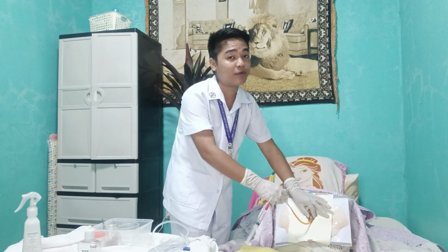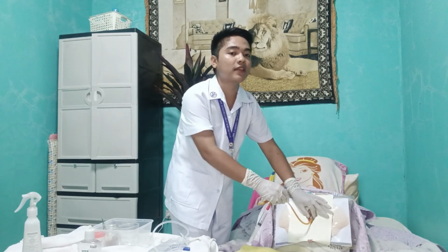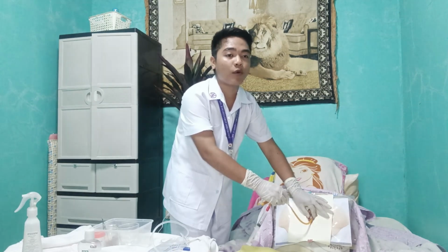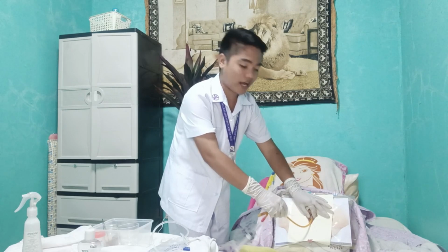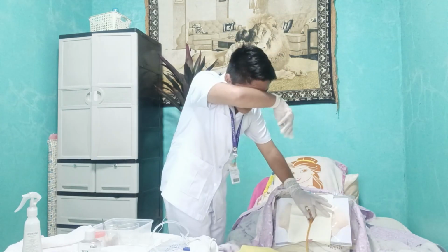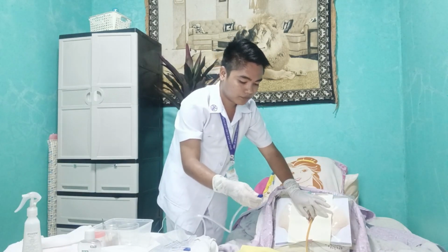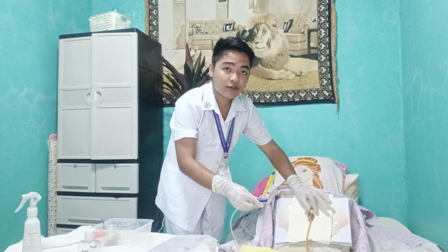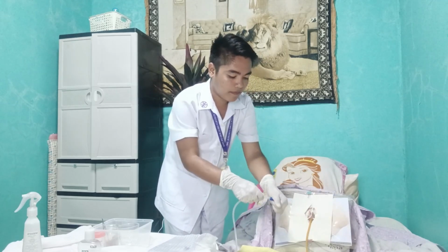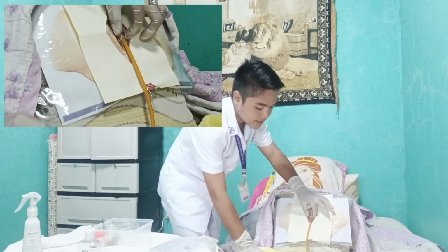The next thing that I am going to do is to connect the catheter with the urine bag, making sure that the urine bag is closed to avoid leakage and maintain the sterility of the connection. We can just grab our other hand. Pull. Flex.